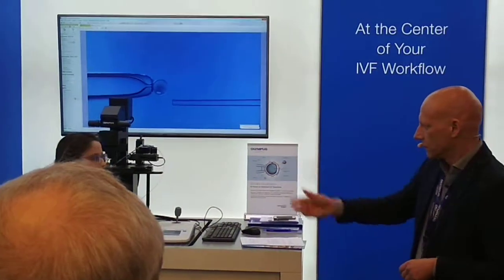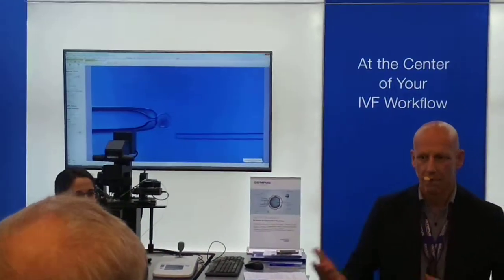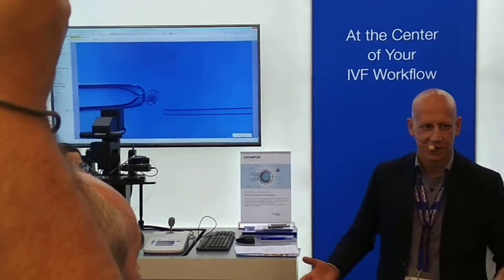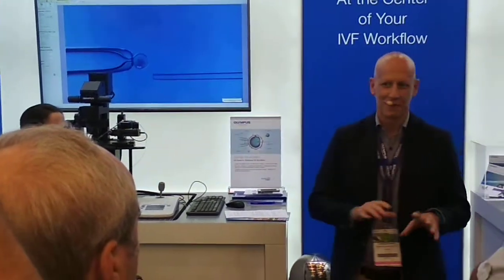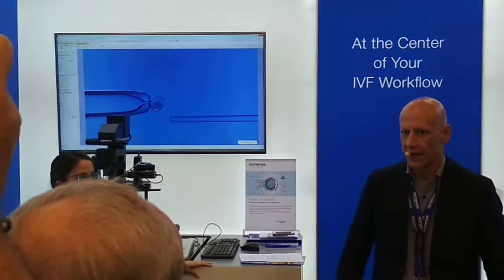First of all, let me introduce Maria from Embryo Tools, here in Barcelona. We are partners, we cooperate. Thanks to them, we have a skilled embryologist, and we also have very nice oocytes that hopefully will show up the spindles in a decent way. So we are playing here with a little bit of risk, but we will try to manage.